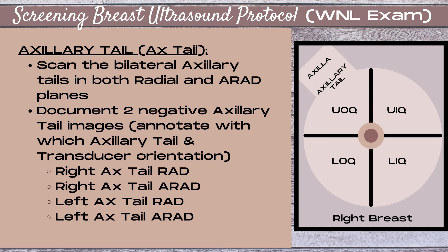Moving on to the next section of our screening breast ultrasound protocol for our normal exam: the axillary tail. This is the normal extension of breast tissue that extends up into the axilla and is connected to the upper outer quadrant of the breast. I will most commonly document this area while scanning the upper outer quadrant since I'm already in that region. This is a very crucial area to evaluate because it's not uncommon for a breast cancer or mass to hide within this tissue. You want to scan both axillary tails bilaterally in the radial and antiradial planes.